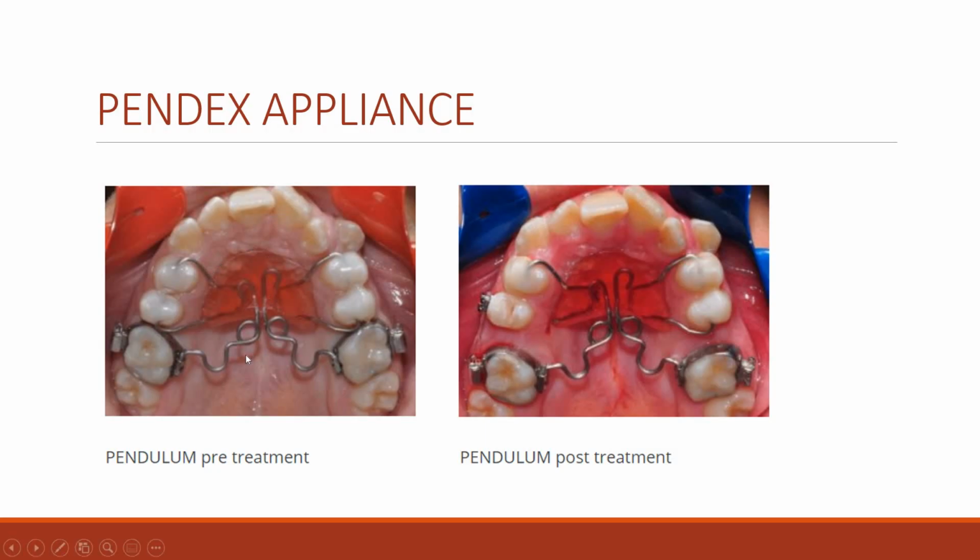Here we present the Pendex appliances, which are also auxiliary fixed appliances for distalization of first molars. These pendulum attachments are made of beta titanium alloys, and they give the distal movement of first molars.